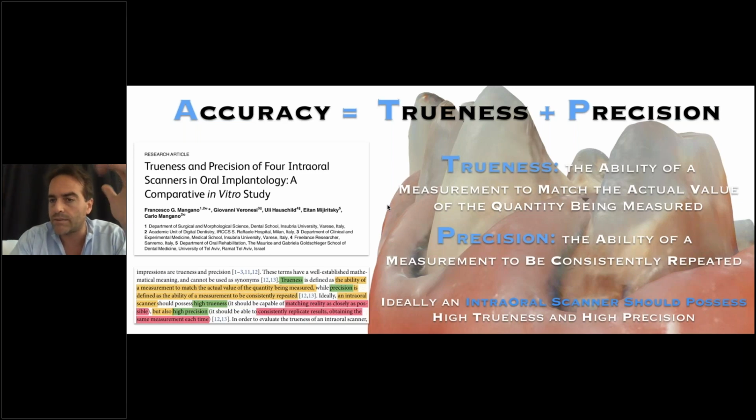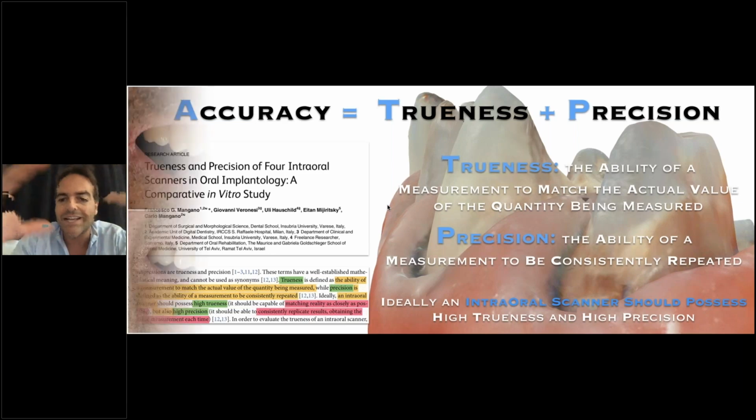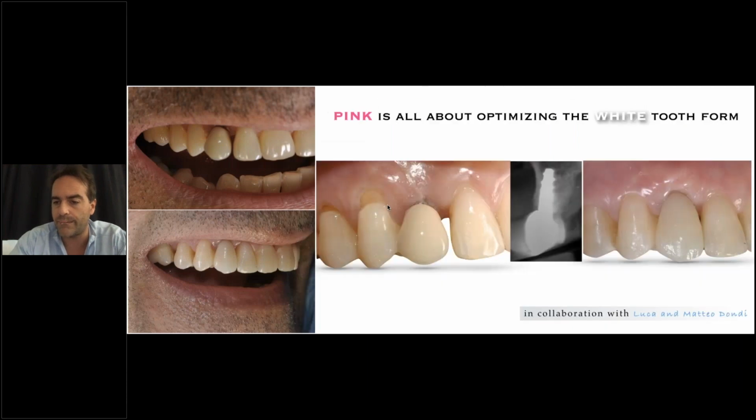And if everything has been done properly, if the interdisciplinary treatment plan decision making has been done correctly, thanks to the new materials, as I just discussed, cubic zirconia monolithic, and the new technologies, intraoral scanners, we are able to improve incredibly the quality of life of this patient just by working on two teeth.